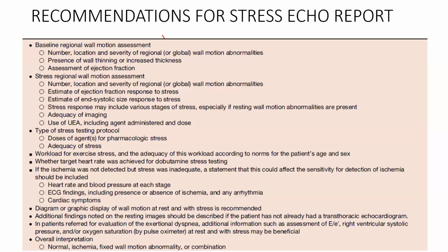Okay, so essentially at the end of this, you conclude, is it normal? There was evidence of ischemia, there was fixed wall motion abnormality, or a combination. Thank you.